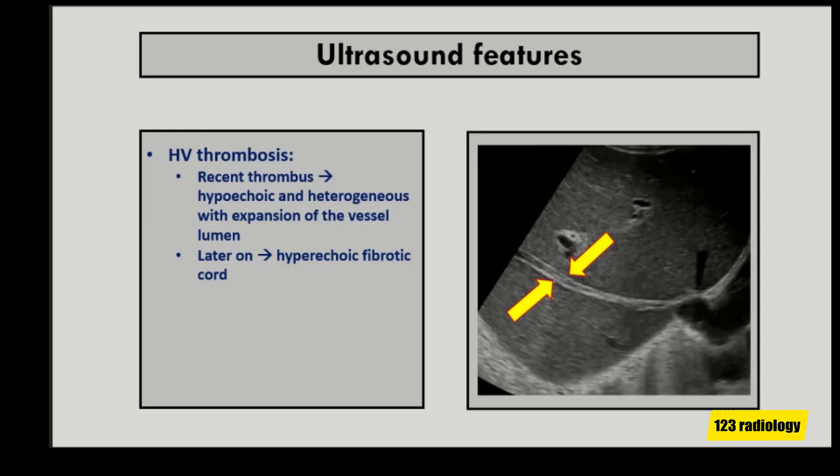In the chronic stage, the thrombosed hepatic vein results in formation of a hyperechoic fibrotic cord, as seen in this image.